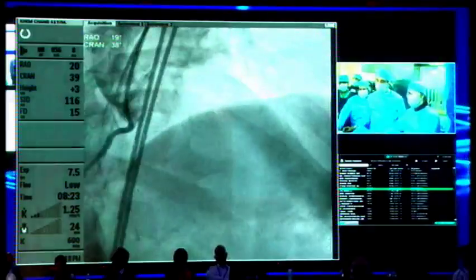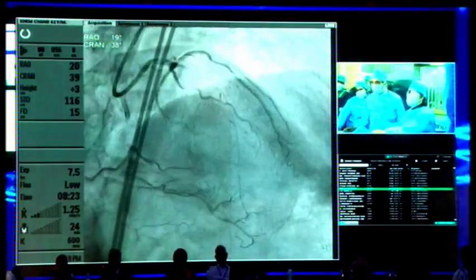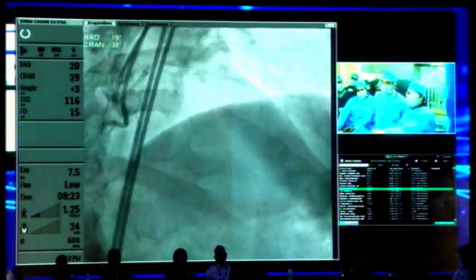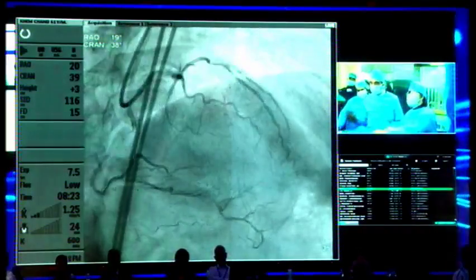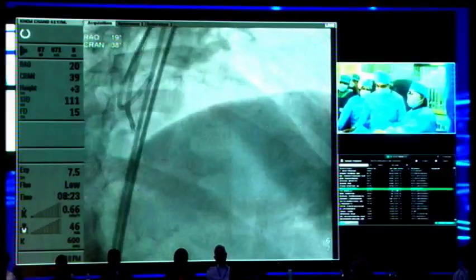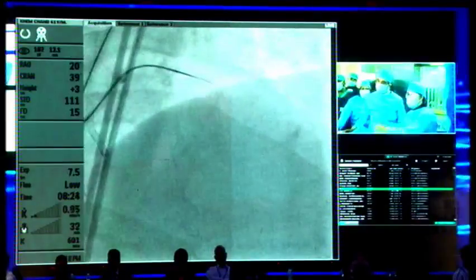Yeah, as it is in-stent stenosis, we are going to feel it's going to be a hard lesion. But I felt that the distal part, the retrograde vessel, was filling up to the distal part of the stent, which is a good point. So we have the marker of the stent as a vessel diameter, vessel size, so we can go in the center of the stent. So right now we try to do some intervention, and this is what we are doing.